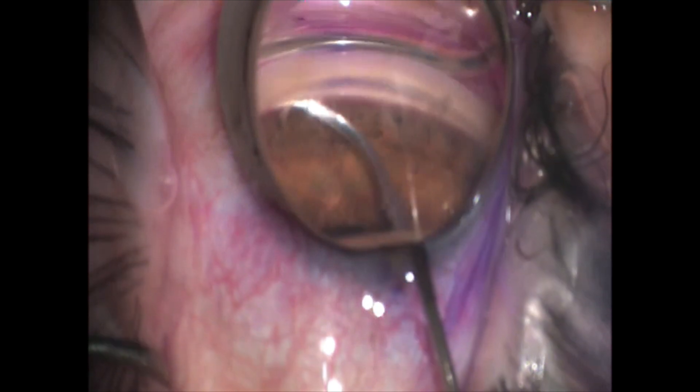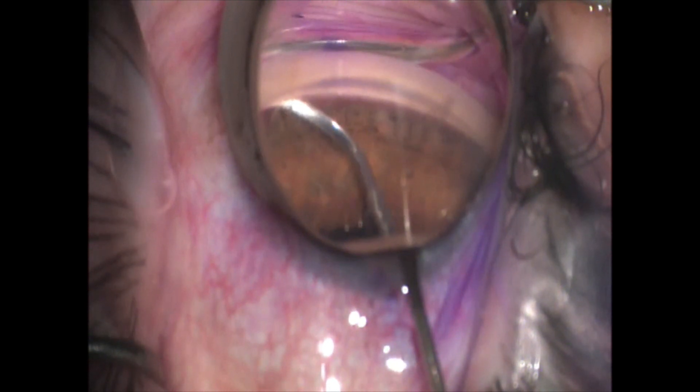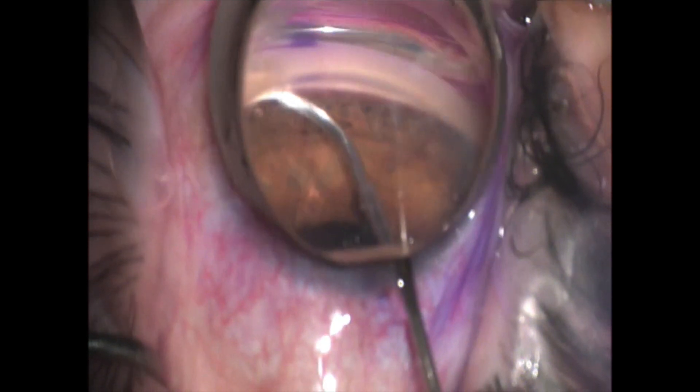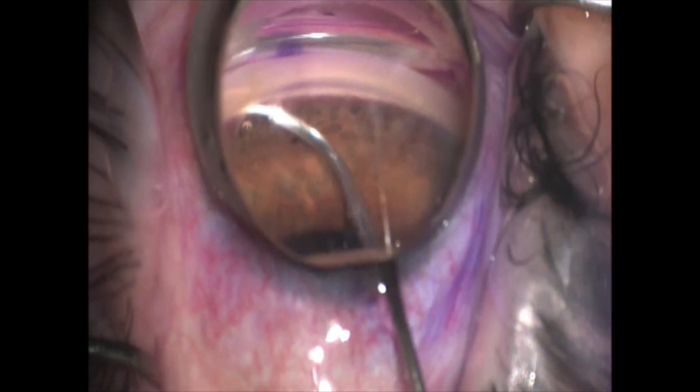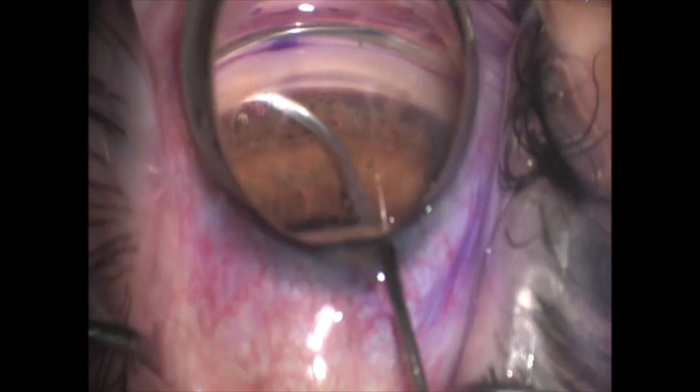My goal here is to pump this approximately 30 times at least every time I go around the eye. I'm pumping it down and then rolling the little button forward. I prefer cohesive viscoelastics when I do these — for this specific case I used ProVisc.